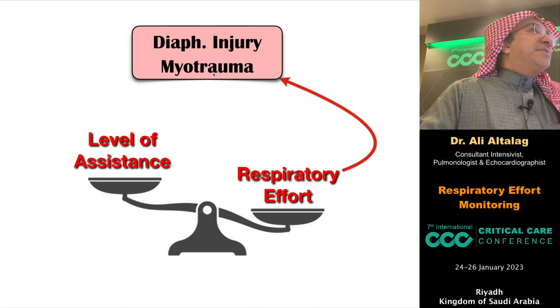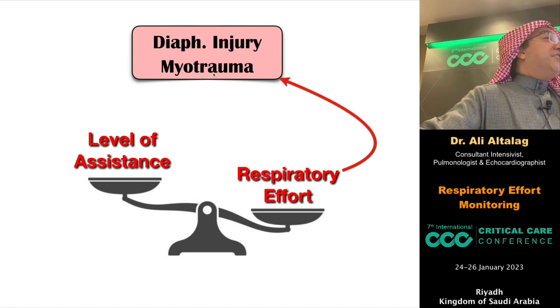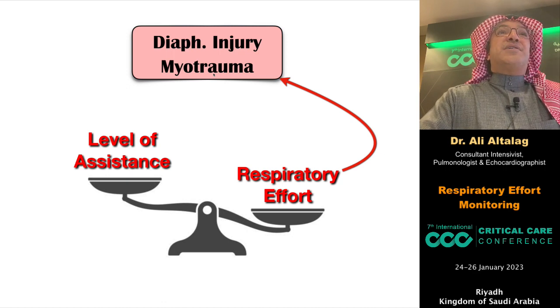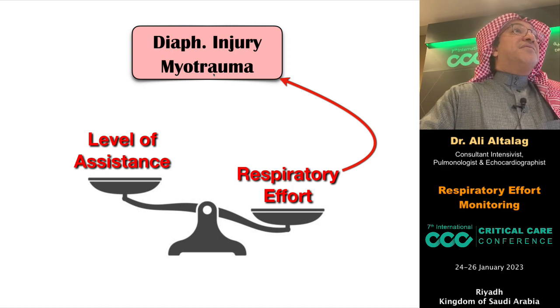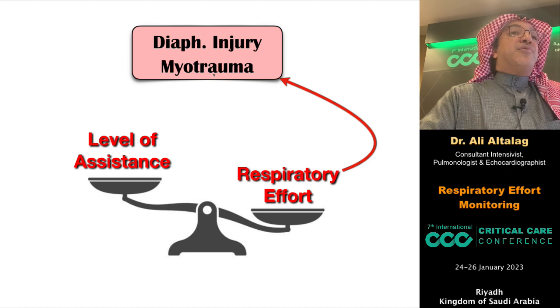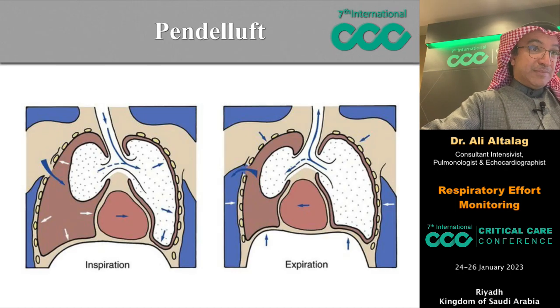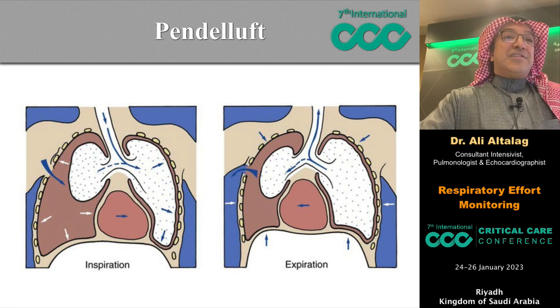And is that important? The answer is yes. If you have such injuries, you can delay weaning, you can cause more trauma to the lung, prolong the intubation period or ventilation period, and you may even increase complications and mortality. So it's very important.